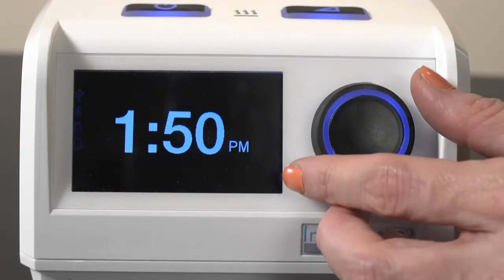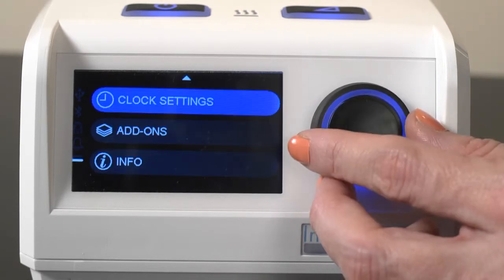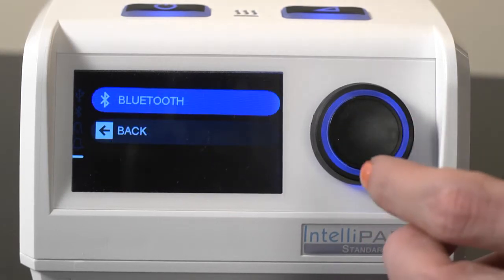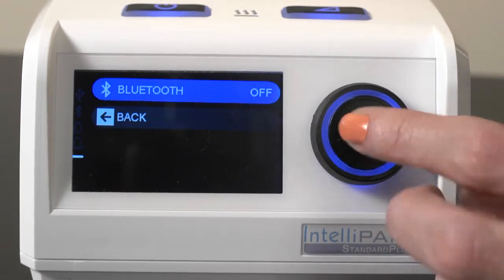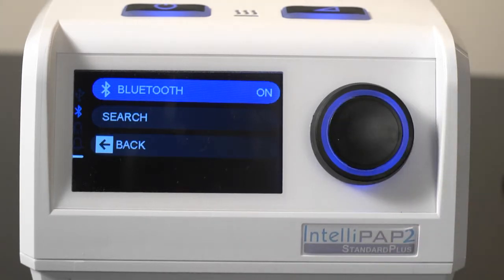On your IntelliPAP2 device, turn the rotary knob until Add-ons is highlighted and press to select. Select Bluetooth and then select On. It is important to leave the IntelliPAP2 on this screen during connection.